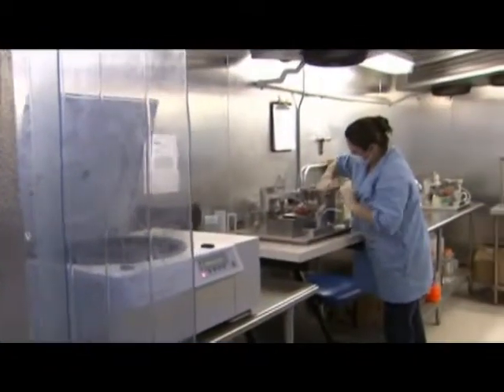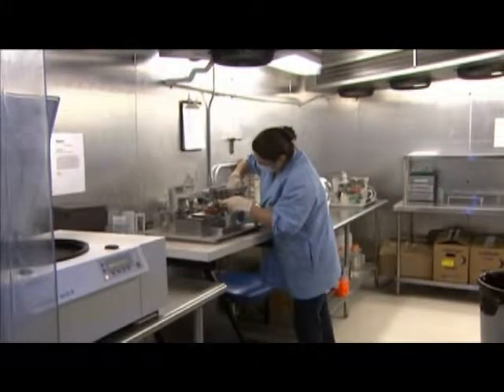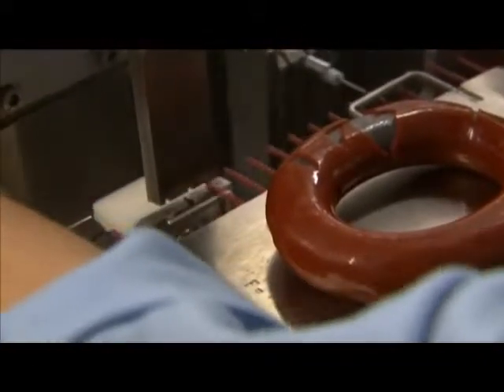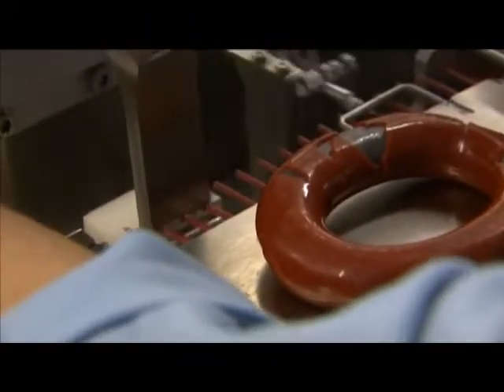After the sorting process, the sorted semen is packed into straws for artificial insemination in our walk-in freezer lab. Each straw is printed with the bull's name, registration number, collection facility code, and the gender of cells included.